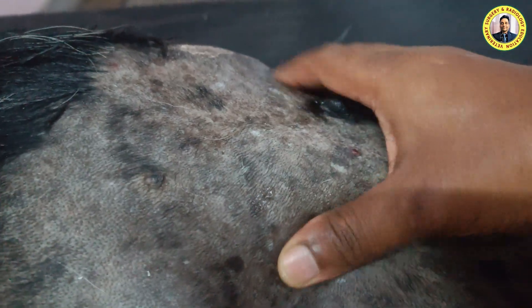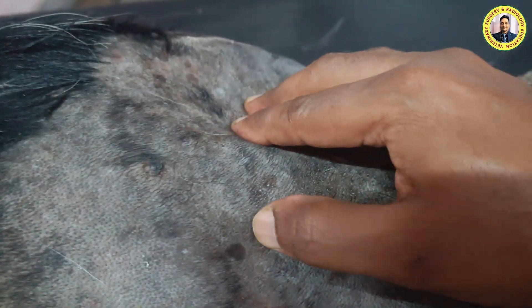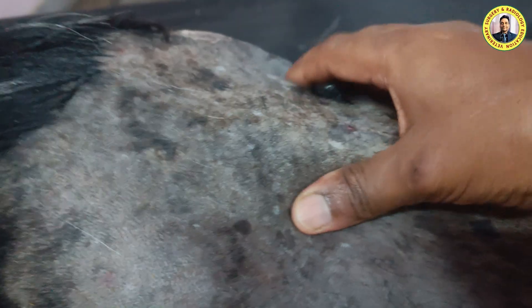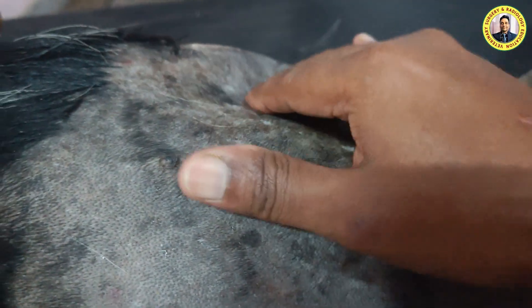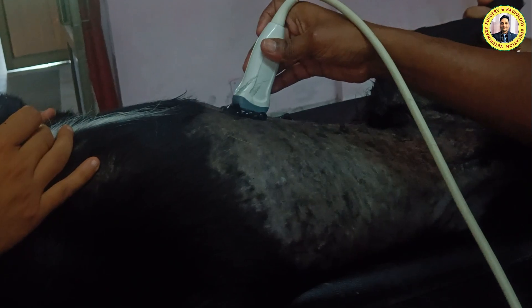When we palpate the left hypochondriac region, we find a hard mass. Upon radiography, there is also suspicion of a splenic mass. Based on radiographic findings and physical examination, we tentatively diagnose this case as a splenic tumor. Now we are going to perform ultrasonography using the microconvex transducer.